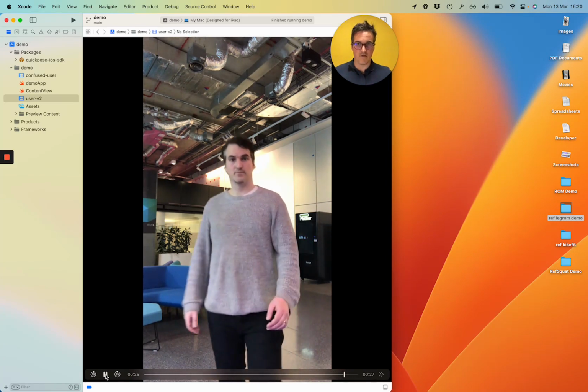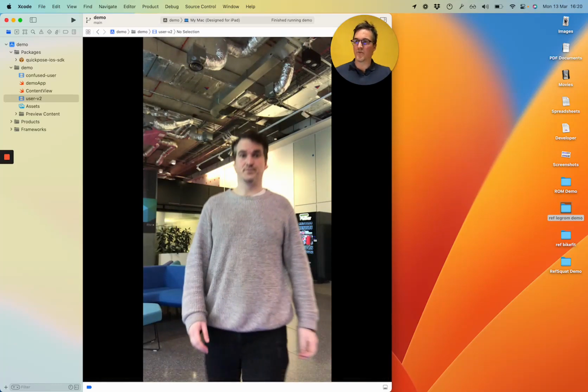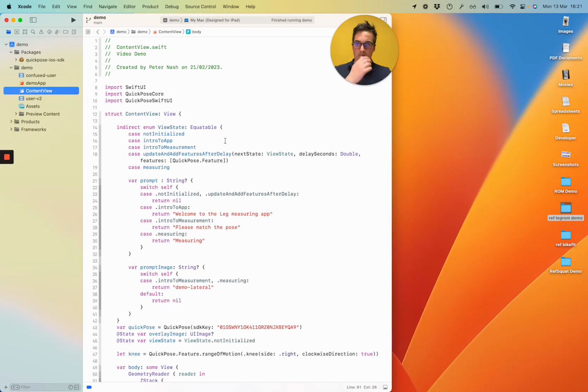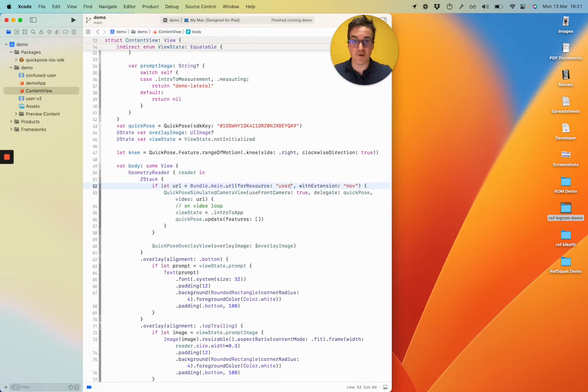And then that's it. That's the end of the video. So this is a bit of a step up from the previous experience, where we just had some confused guy staring. Don't get me wrong, that might be a significant part of your user base. Let's just load the video in.